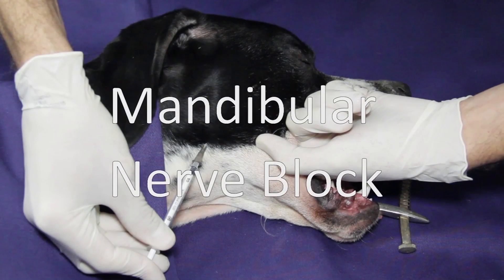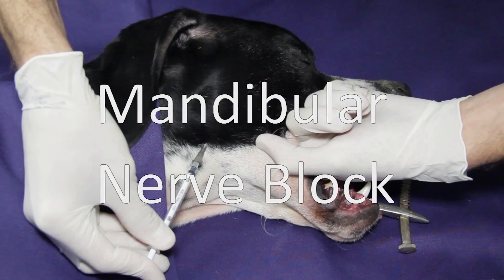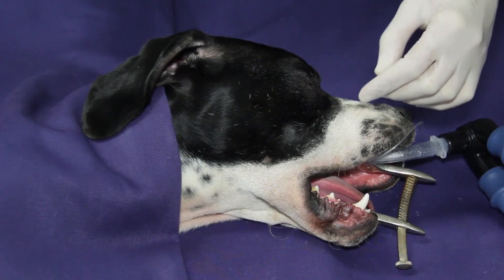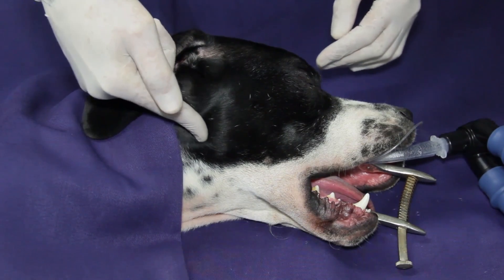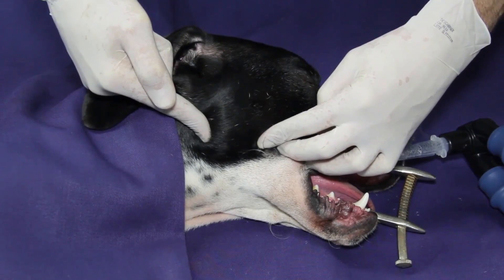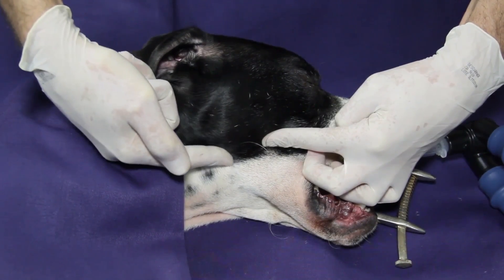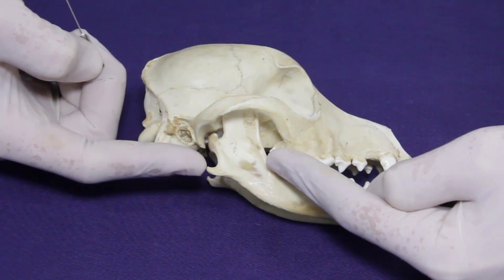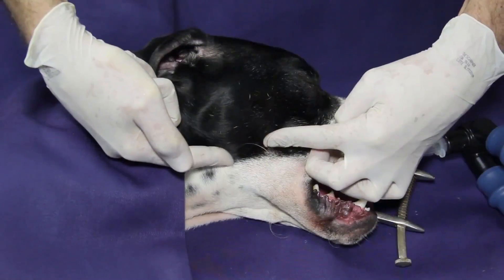The mandibular nerve block, also referred to as the caudal inferior alveolar nerve block. The important landmarks for this block are the angular process of the mandible, the last molar tooth, and the concavity on the ventral margin of the mandibular ramus.